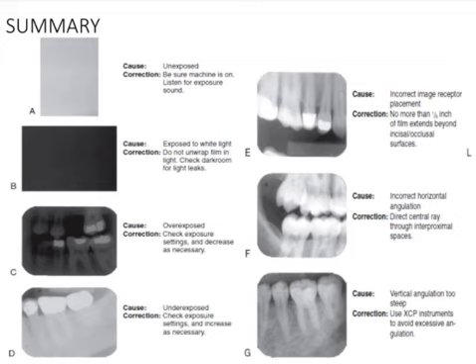Number C is a high density radiograph. It can be because of overexposure factors or processing factors. So here it can be either overexposed or overdeveloped. Then D, it's underexposed. That means less developed, because of either low exposure factors or, if it's a processing solution, less time in developer and more time in fixer.